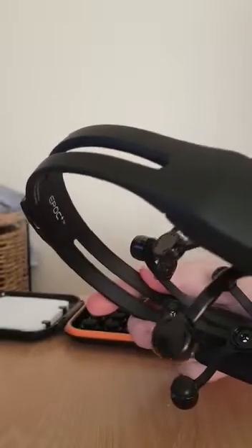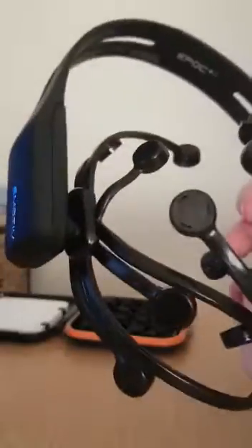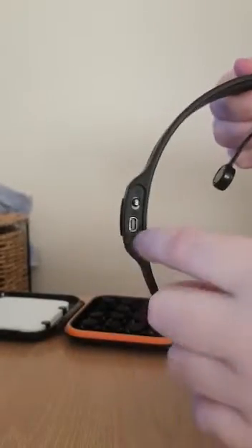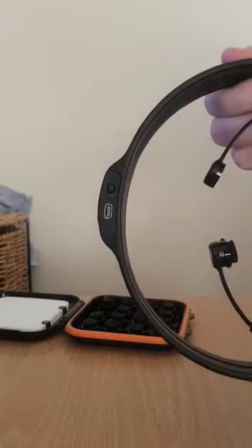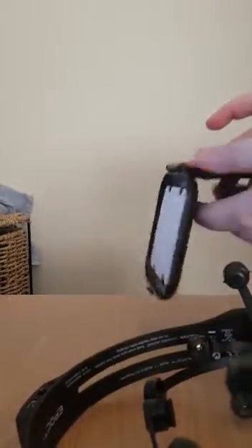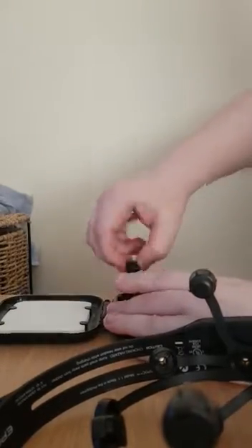This is an electroencephalogram, otherwise known as an EEG. It comes with several connectors which have contact pads that travel through the headset to a chip, which you can then wire to your PC via the attaching wires that come with it. It also comes with these felt connector pads.